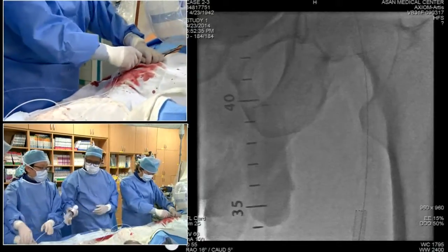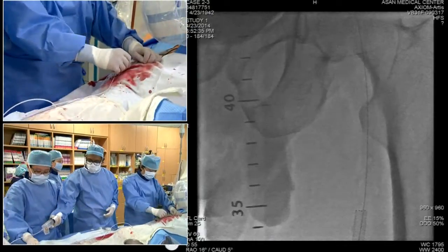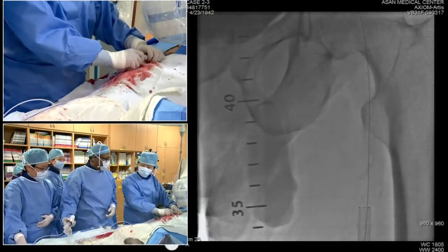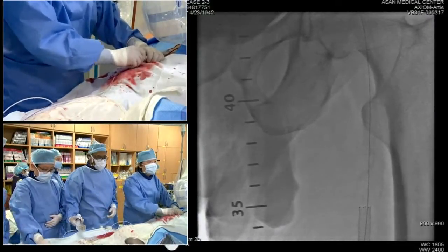Okay. Well, I haven't seen an angiogram of the distal vessel yet, so I have no idea what we're treating down or seeing downstream. So that would be important to know.